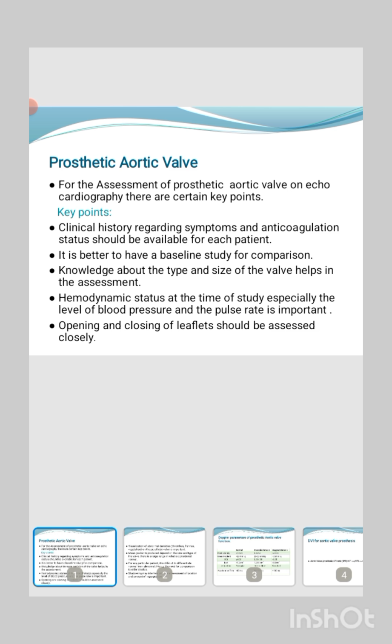I hope you will understand and assess the prosthetic aortic valve. For the assessment of prosthetic aortic valve by echocardiography, there are certain key points. Number one, clinical history regarding symptoms and anticoagulation status should be available for each patient. Number two, it is better to have a baseline study for comparison.